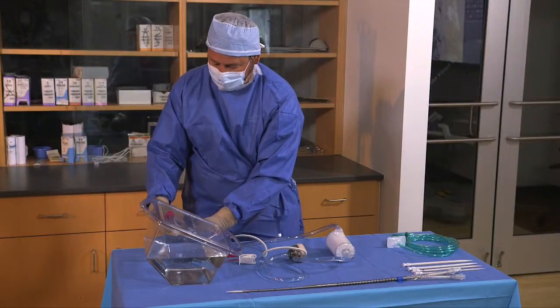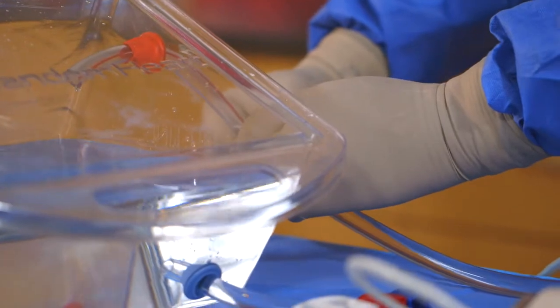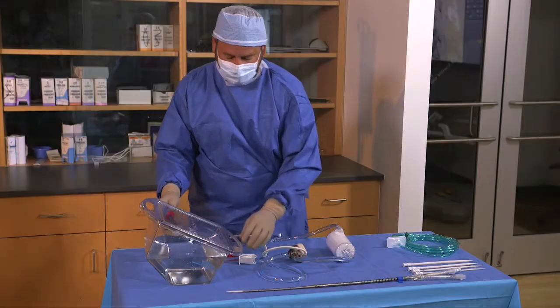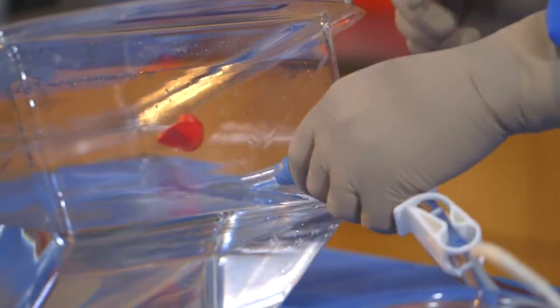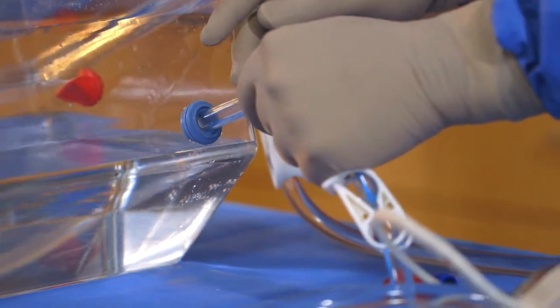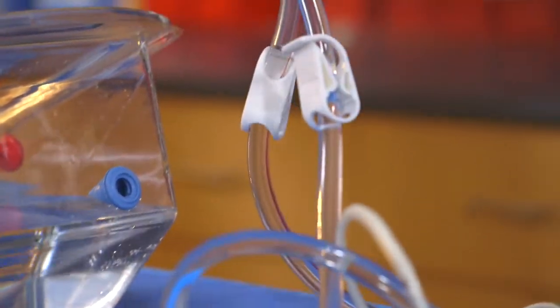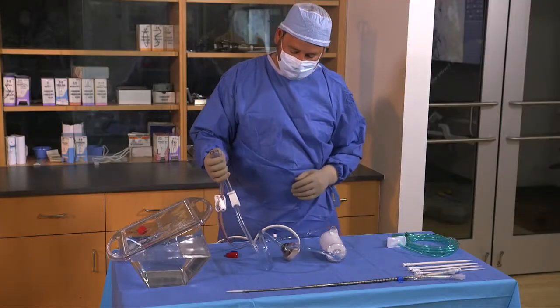The sterile operator clamps the inflow and outflow tubing below the fluid line. The sterile operator makes a final inspection of the pump, oxygenator and tubing to verify that all air has been vacated.